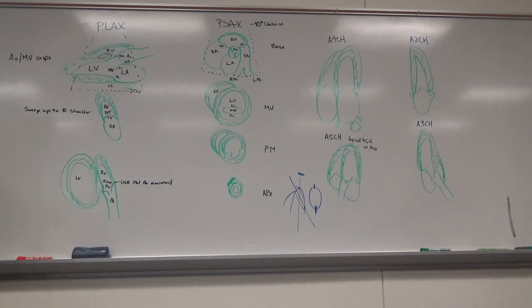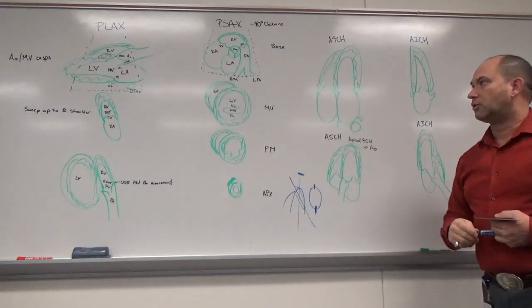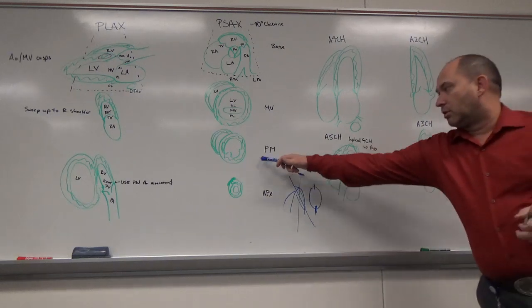Mid LV. So this is base level. Base level of the muscle, the mitral valve level. Don't confuse that with the base level of the valves. Okay? The valves are formed with a skeleton. It's a fibrous skeleton. It's insulated, so it doesn't allow electrical conduction across it, except for through the bundle of His and AV junction. So this level here, what are we looking at?